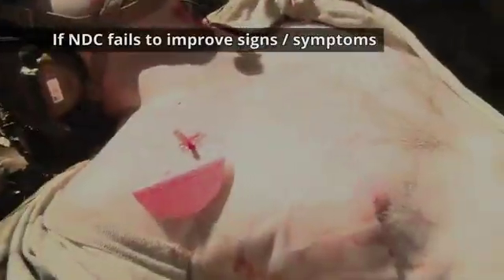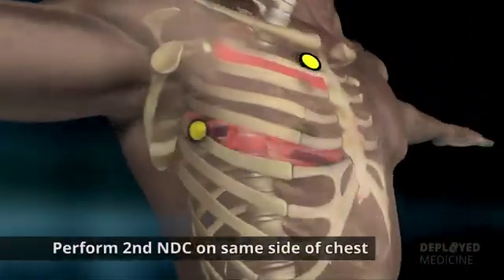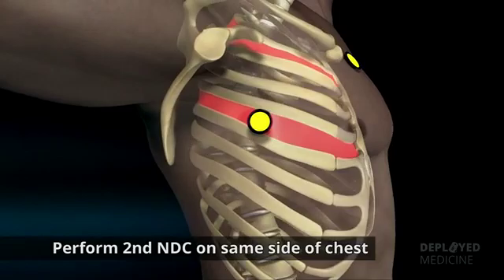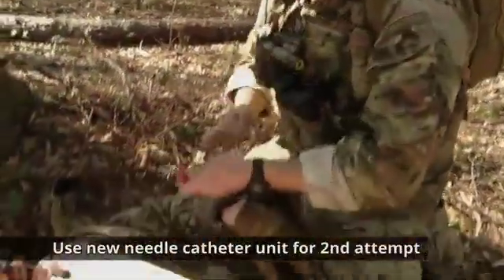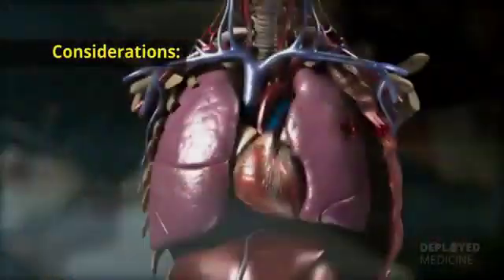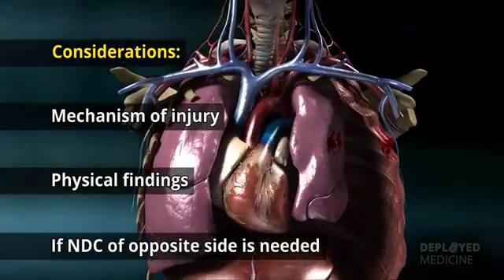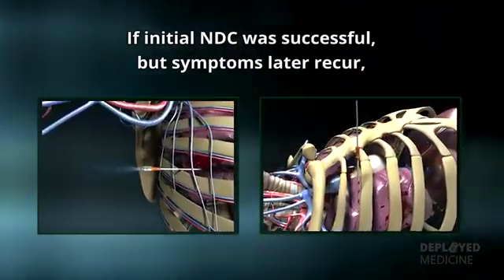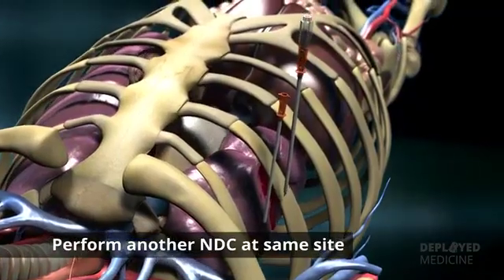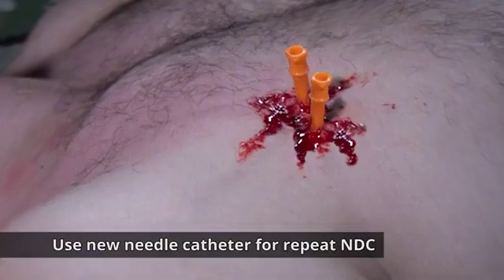If the initial NDC fails to improve the casualty's signs or symptoms from the suspected tension pneumothorax, perform a second NDC on the same side of the chest at whichever of the two recommended sites was not previously used. Use a new needle catheter unit for the second attempt. Consider, based on the mechanism of injury and physical findings, whether decompression of the opposite side of the chest may be needed. If the initial NDC was successful but symptoms later recur, perform another NDC at the same site that was used previously, using a new needle catheter unit.